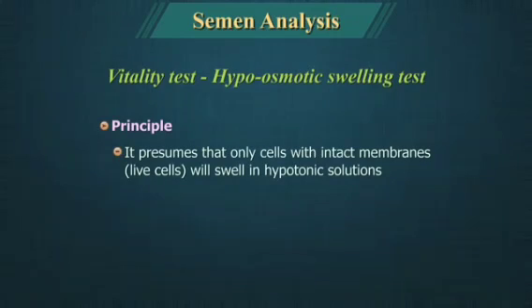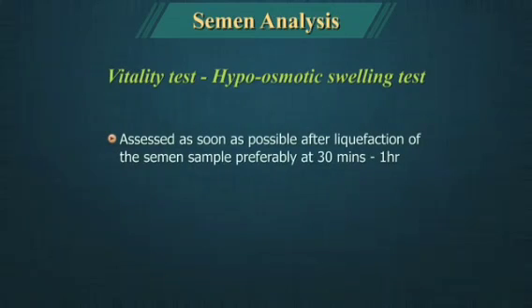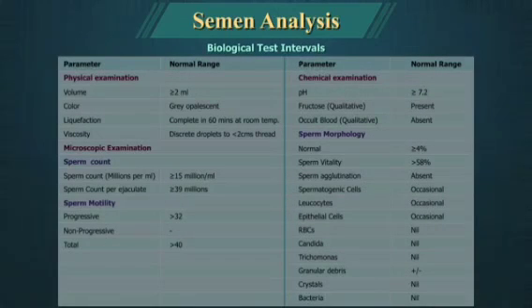swell in hypotonic solution. Sperm vitality should be assessed as soon as possible after liquefaction of the semen sample, preferably at 30 minutes and latest within 1 hour of ejaculation to prevent deleterious effects of dehydration or changes due to temperature. The biological reference intervals for semen are as follows.